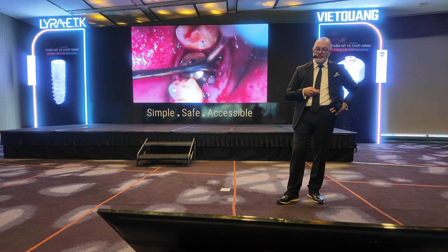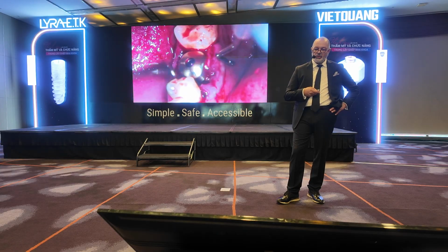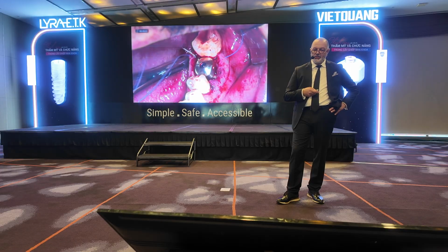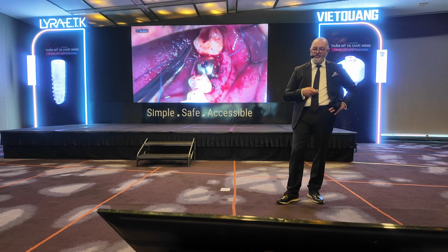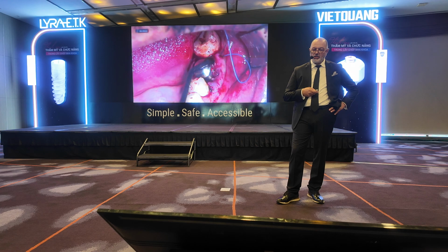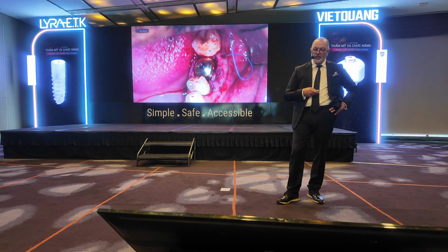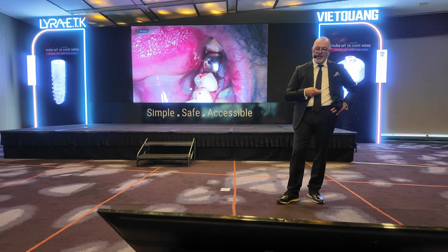So we always put these implants, the iphysio abutment, and if we use artificial bone, we try to cover that with platelet-rich fibrin, the PRF.